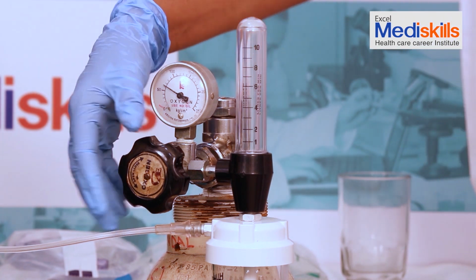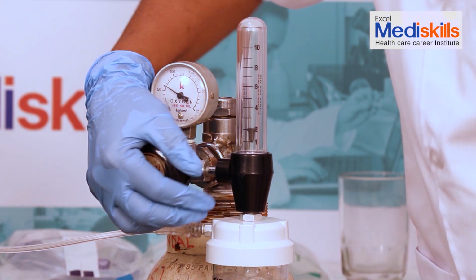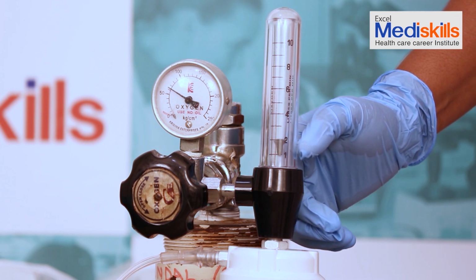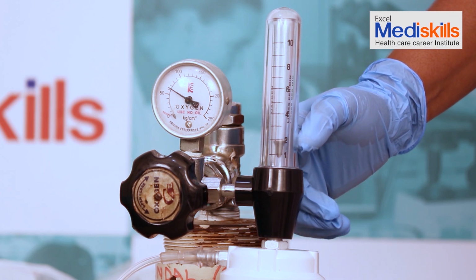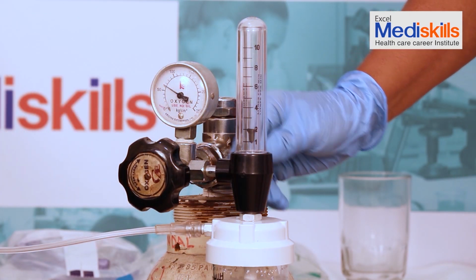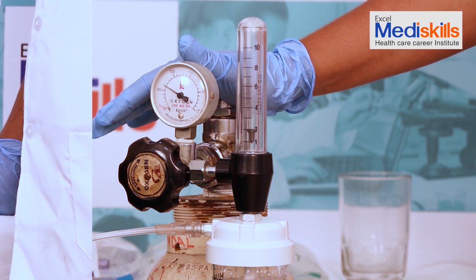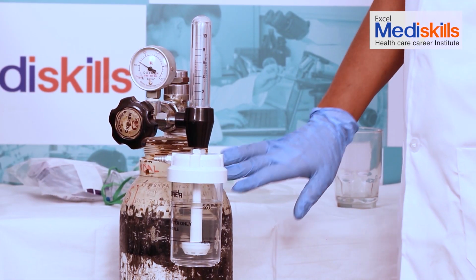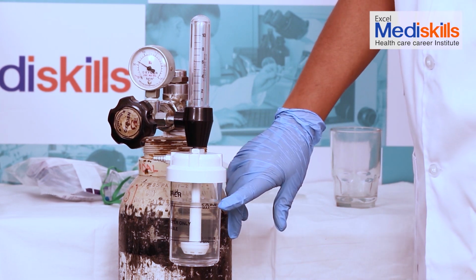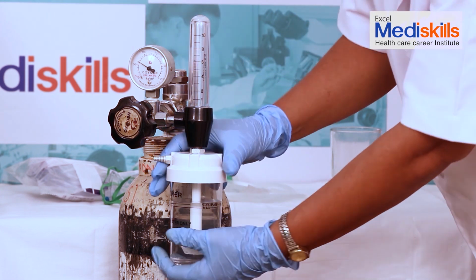And then we will turn on the knob of the cylinder and, with the help of the flow meter, titrate the oxygen. Now you can see the flow meter. This flow meter will show the flow of oxygen required. With this knob, keeping a maximum of 2 liters, we give oxygen to the patient through the nasal cannula. When we gave oxygen in the nasal cannula, the water level was maximum. But since that did not ease the patient's breathing trouble, we will now increase the level of oxygen.